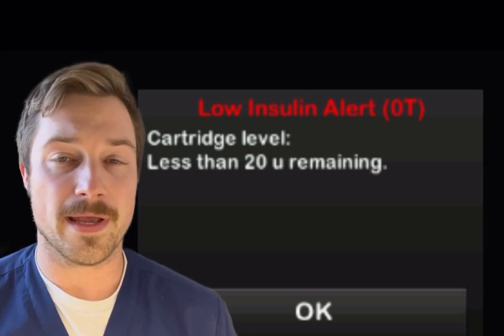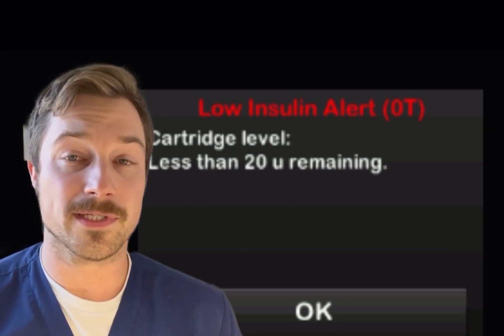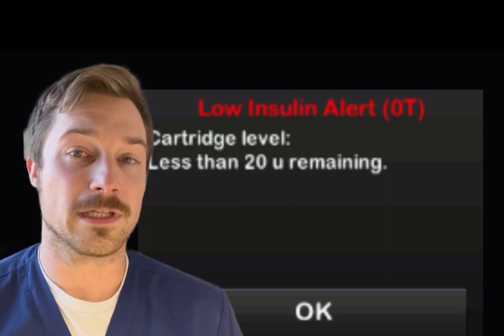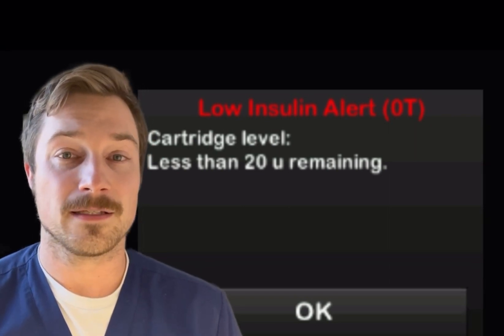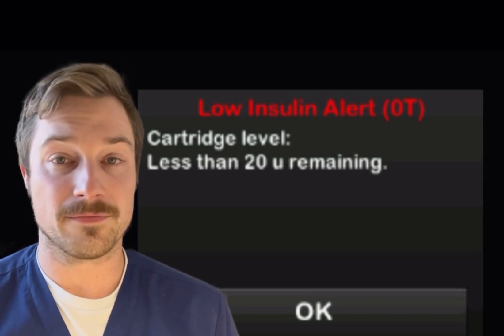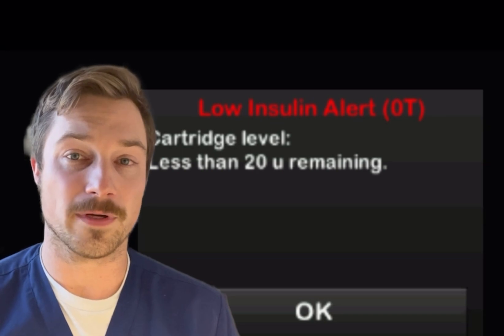I do recommend that you try to avoid the 10 units. I say this because you won't have ample time to be able to change your insulin pump. And if you're being alerted only when you have 10 units left, depending on your situation, you might not have enough time or you might not have the supplies easily at hand to be able to change your pump before you run out of insulin.